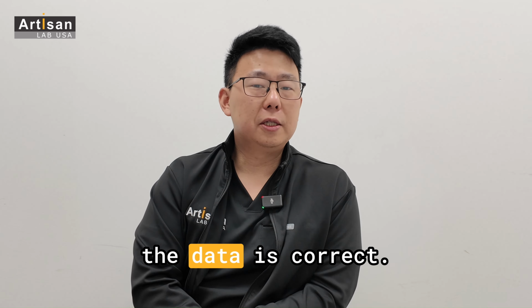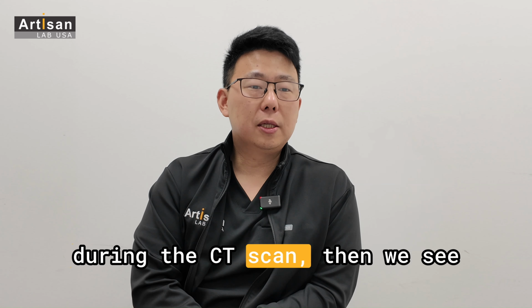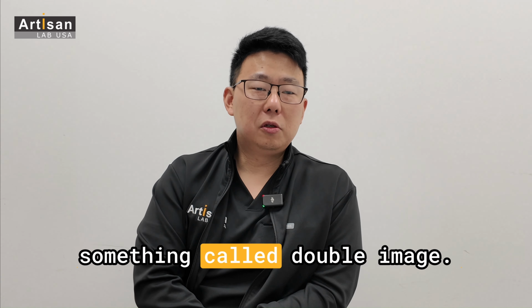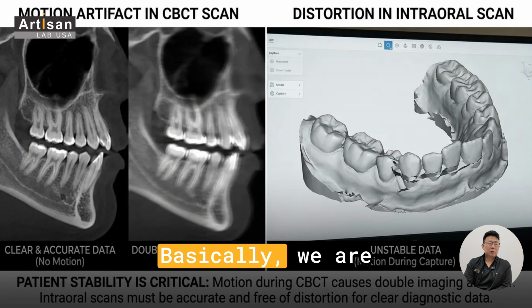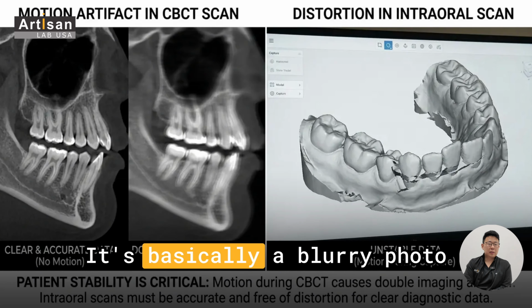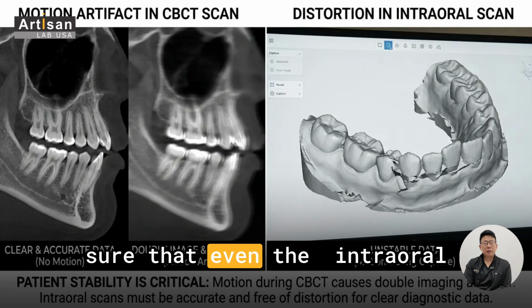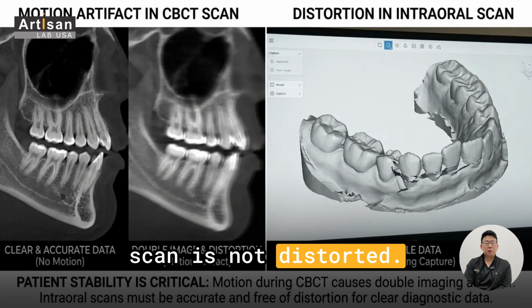To make sure the data is correct: if the patient was moving during the CT scan, then we see something called double image. Basically, we're seeing multiple images instead of just one. It's basically a blurry photo. So we need clear data, and we also have to make sure that the intraoral scan is not distorted.